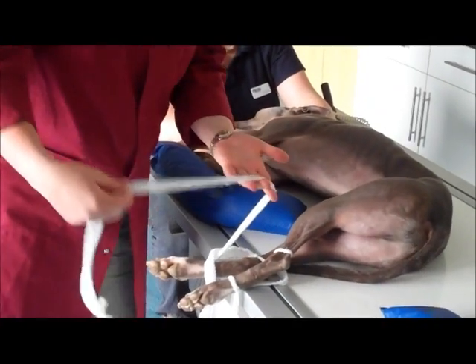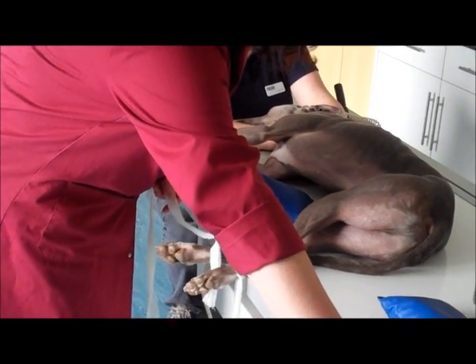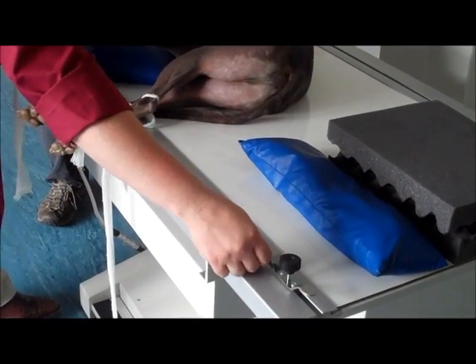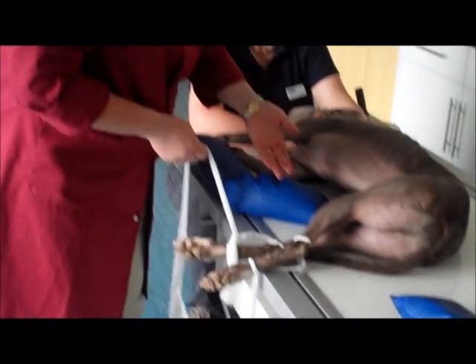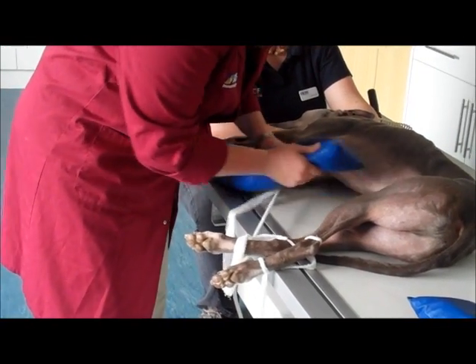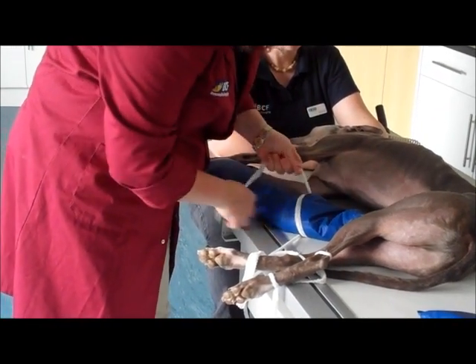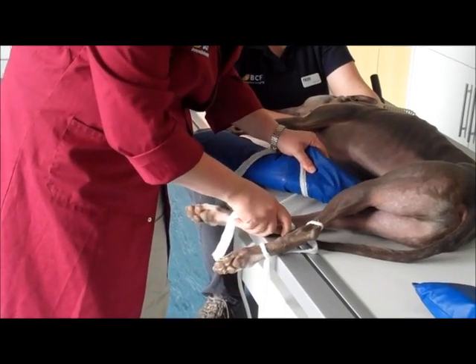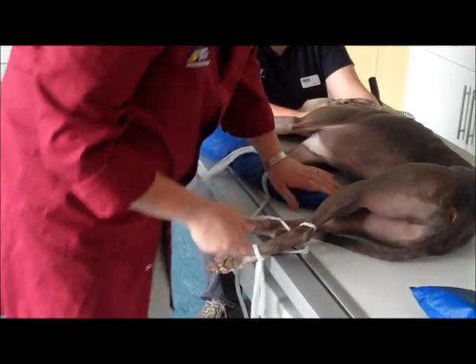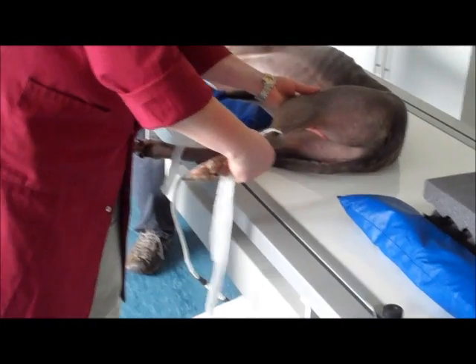You can use whatever form of restraint you have, whether it's a dedicated bit of equipment on the actual table itself to wrap the restraint around, or you can use sandbags as well. So we'll pull the dependent leg cranially, and then pull the leg that's on top, caudally.